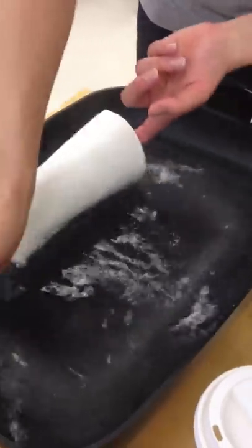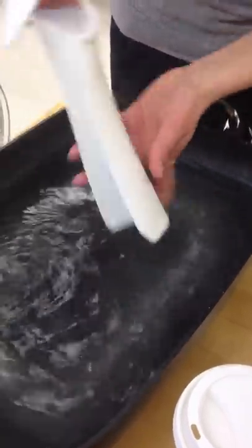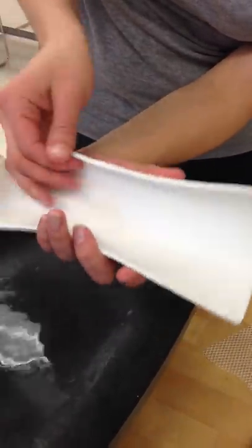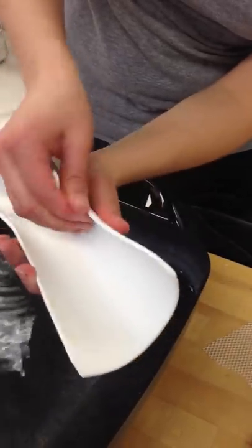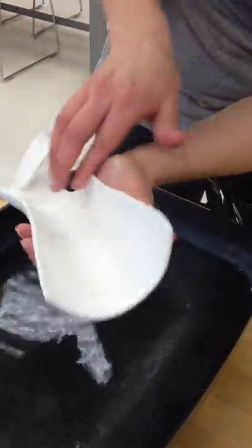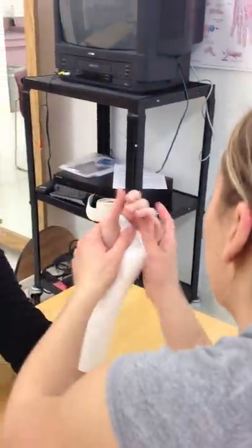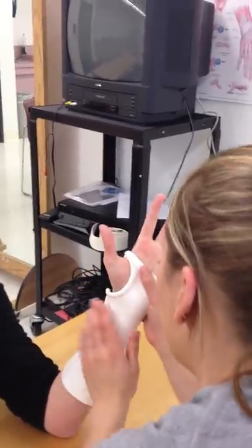I'll do the whole side. As I smooth, I'm kind of rolling it out. That'll still be nice and smooth on the patient. If I think I'm getting it too soft in some places, I'll just go back to my patient and make sure it's fitting well. Always look at the hand piece — that's going to be the most important.